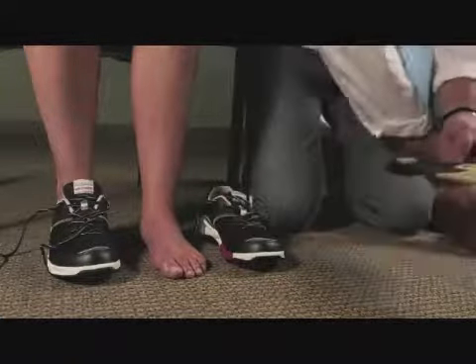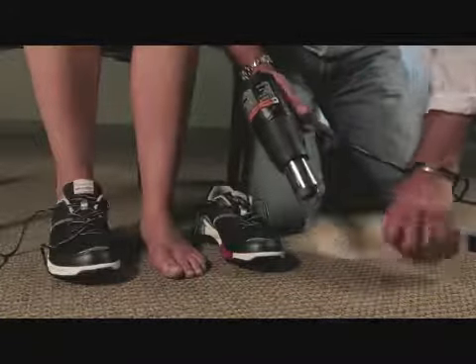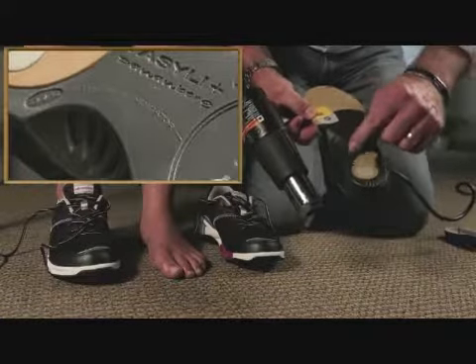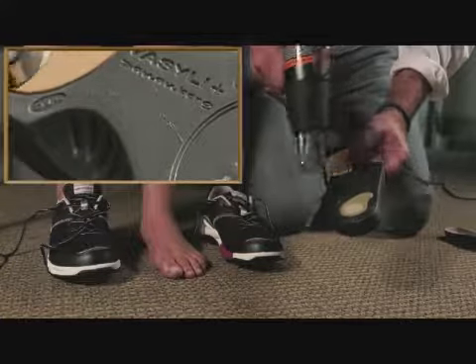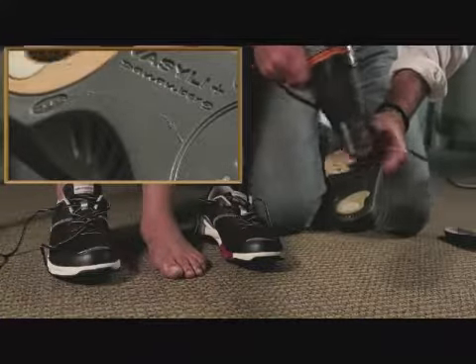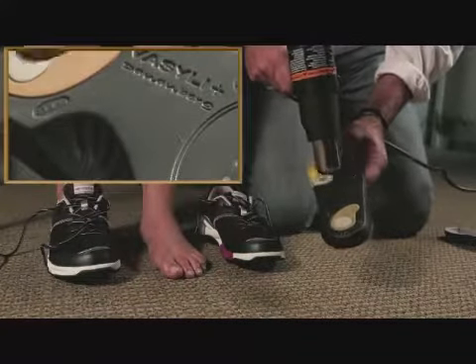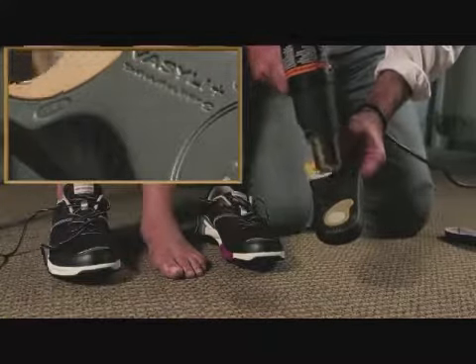We're going to take the orthotic and with a heat gun, we're going to be using a waving motion over the product through the thermal indicator until that disappears. It's important to keep the heat gun moving and not concentrate the heat in any one spot. As we heat the base of the orthotic, we see that the thermal indicator disappears.